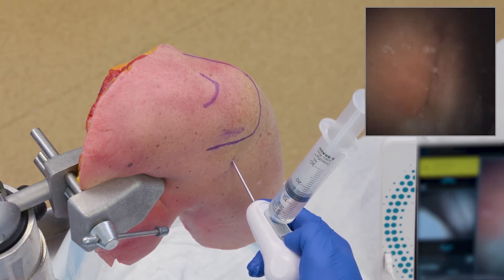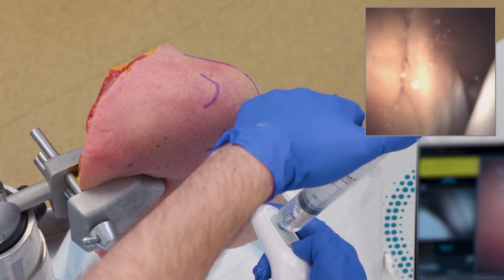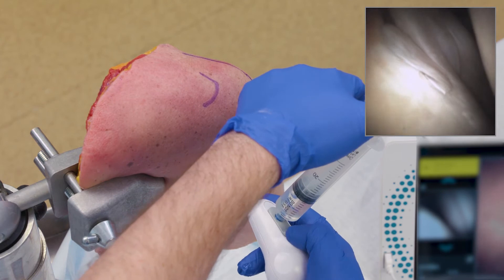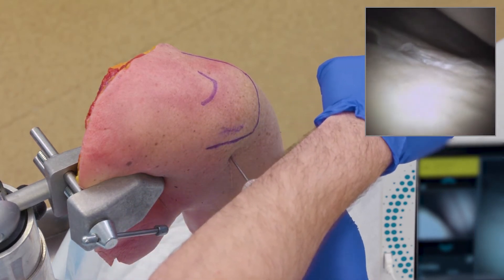In the front of the shoulder here, I'm looking at about the three o'clock position. There's a divot in the pear of the glenoid and I can see my labrum attaching there. I can swing down underneath the humeral head, almost going lateral, just by turning my hand.